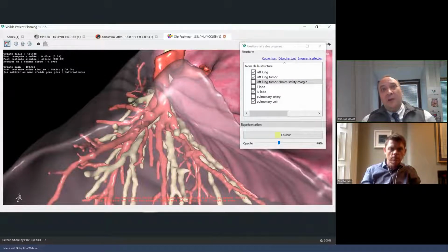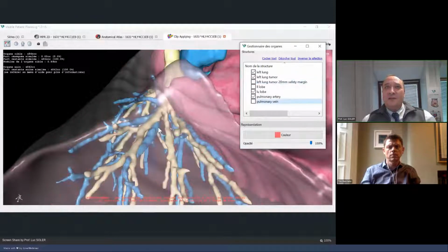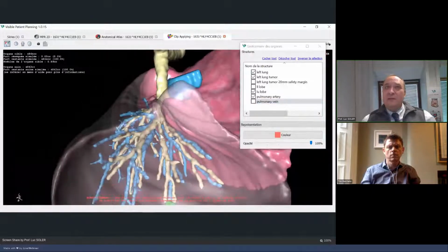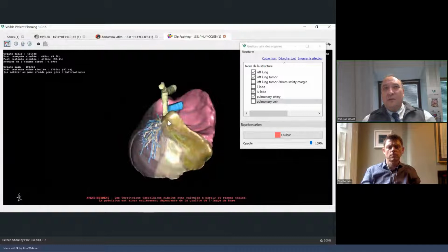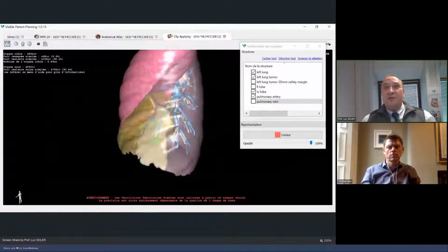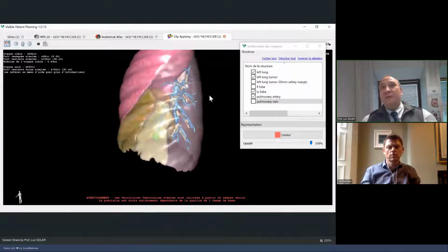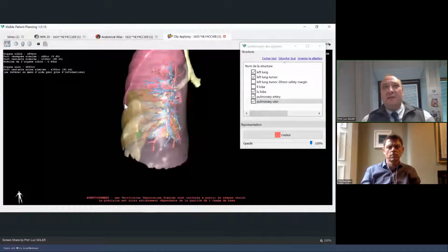So if I clamp this vein, in the same way as the arteries we have seen just before, I can resect these two segments together much more easily, in order to avoid any difficulties for the blood supply, and I will be sure that the remaining lung will be totally safe because it will have drainage and vascularization that is totally efficient.